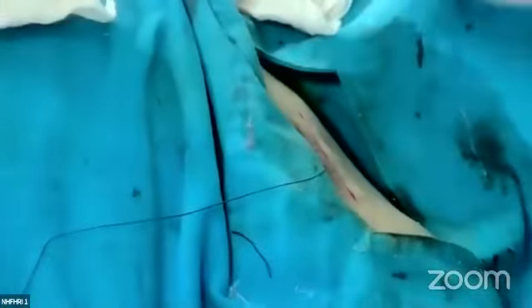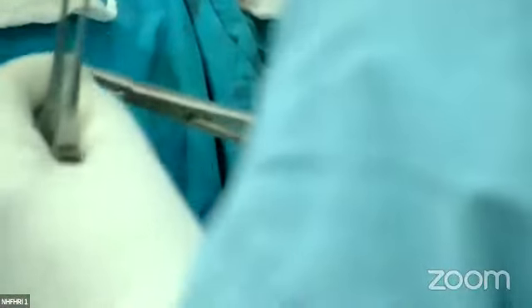And we used to give antibiotic locally into the pocket.